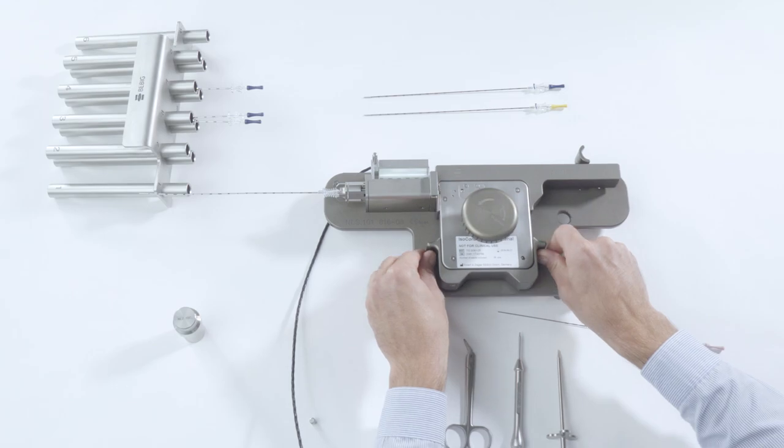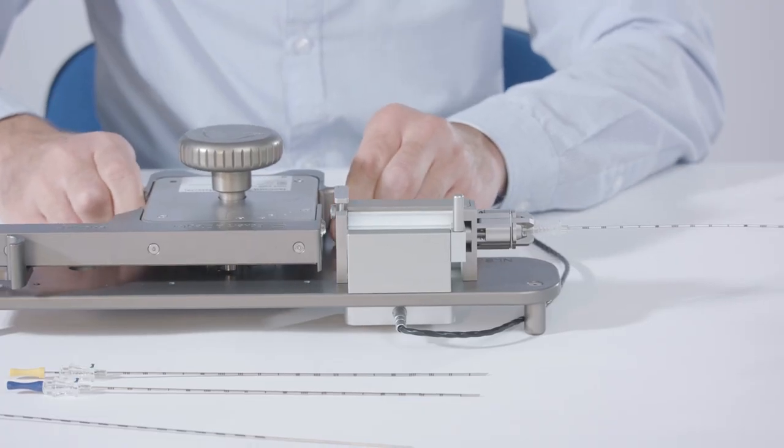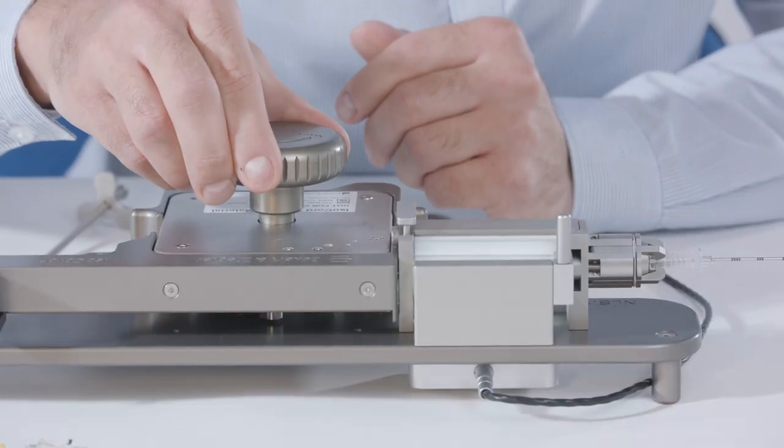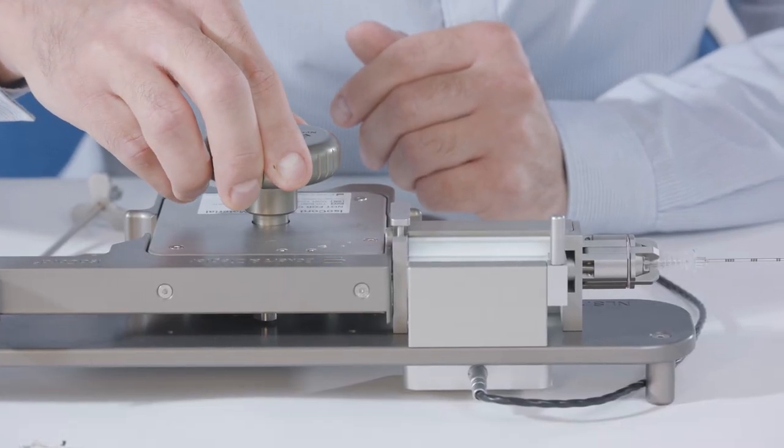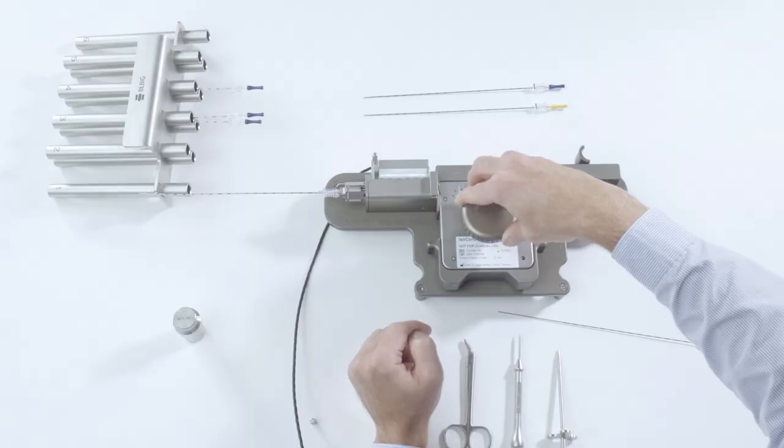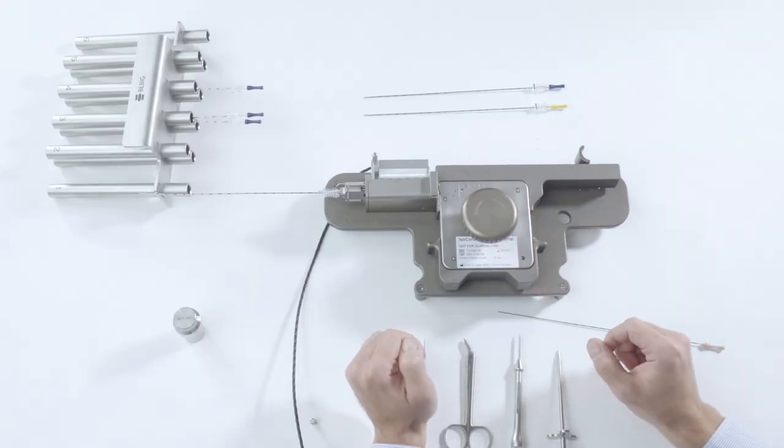Next, configure the seed chain by moving the magazine holder with your thumbs from the mandrel position to the isocord position. This position is reached when the magazine holder is flush with the cutting system and the ball catch clicks back into place. Turn the knob counter-clockwise in the direction marked needle to move the seed chain out of the magazine.